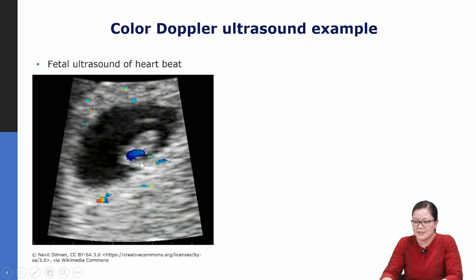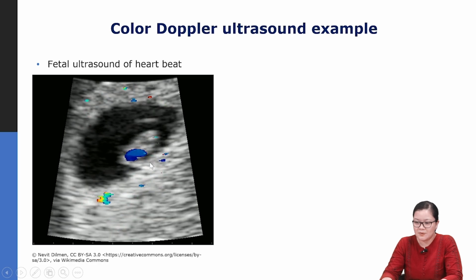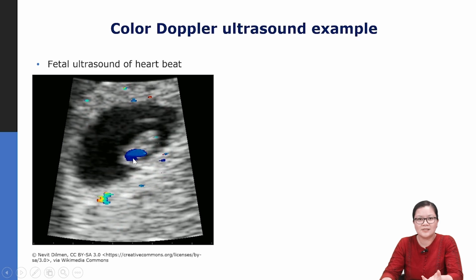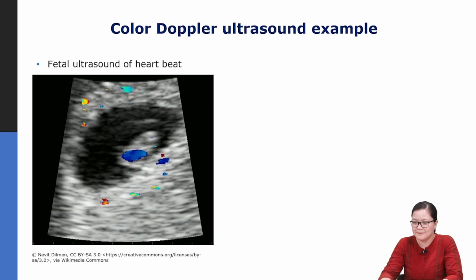Now you can see that as the heart is beating, of course, you see motion around the placenta, but also some changes in the blood flow right here, indicating that the heart is developing properly. Okay.